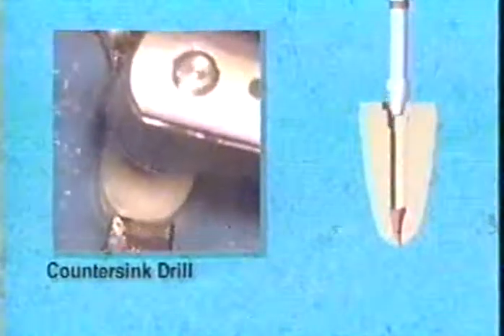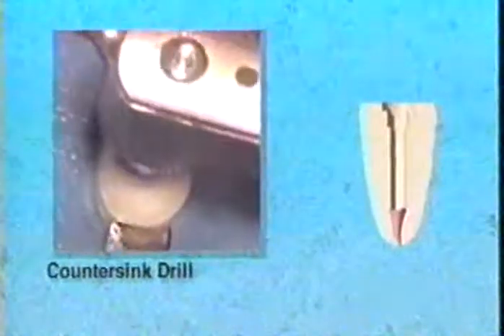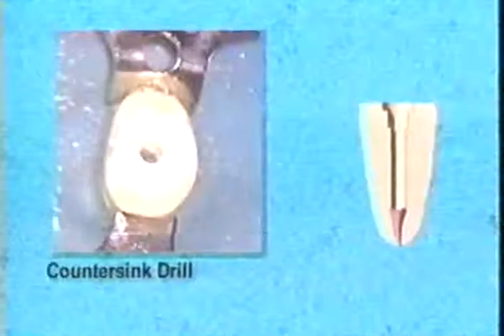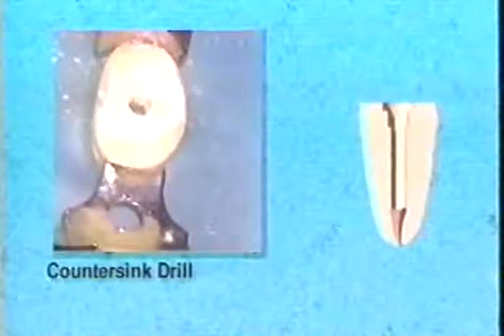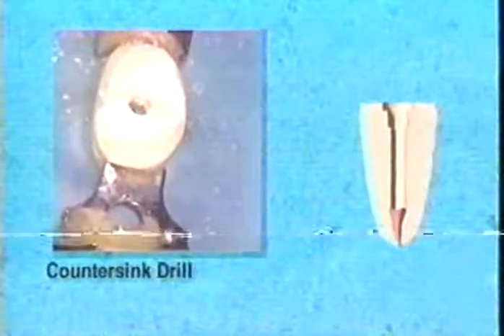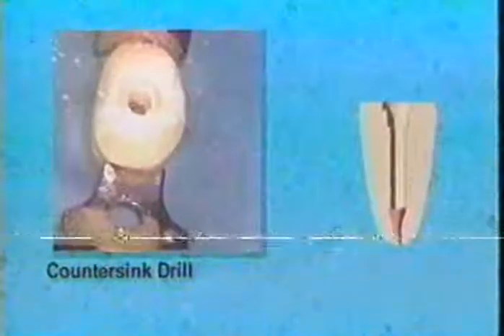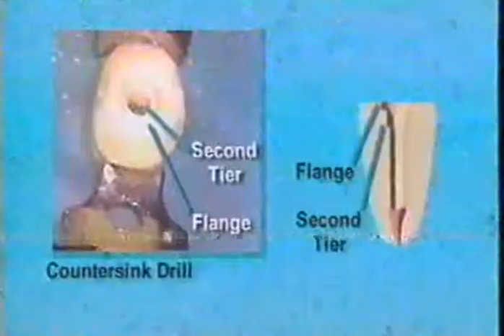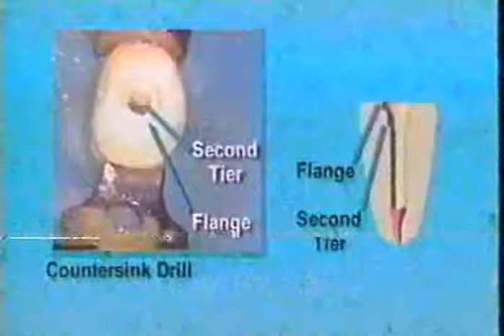Within moments, you will have machined the perfect seat for the Access Post Overdenture. It is important to note that the countersink root facer is not self-limiting and can be used to further deepen the dual preparations if needed to provide more clearance for the overdenture post and cap. Please observe the well-defined countersink and root-faced preparations. The Access Post Overdenture is now trial seated. If the flange of the post is not fully seated within its preparation, the post must be cut.